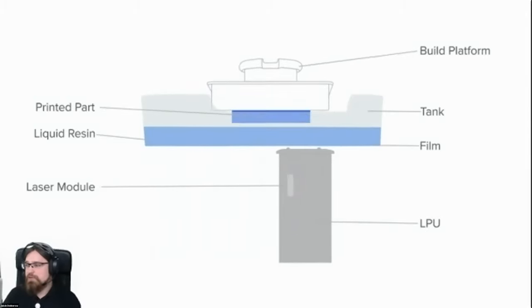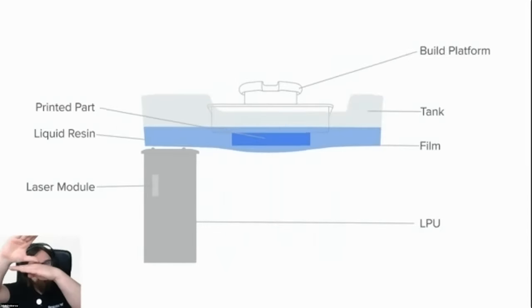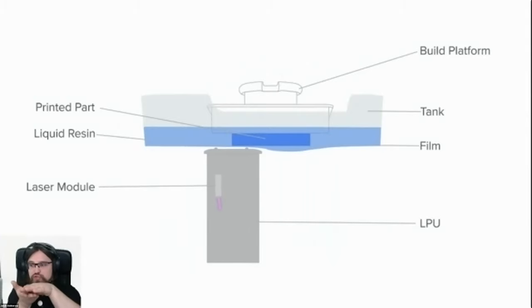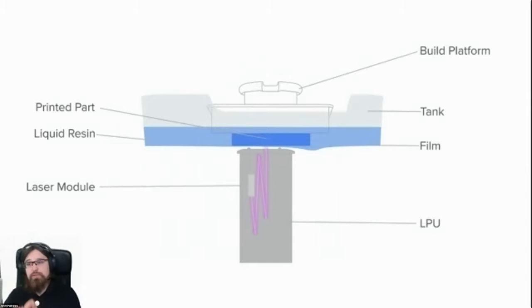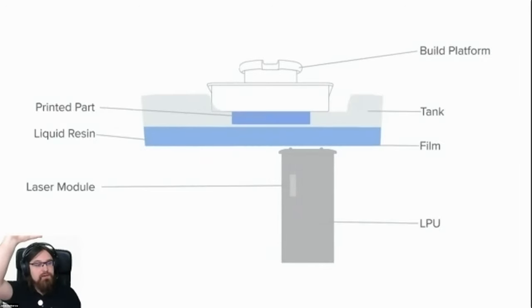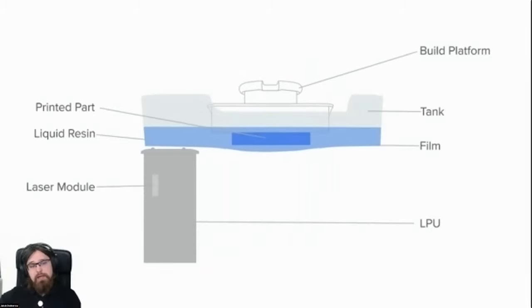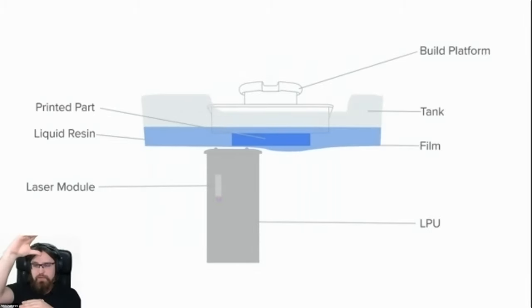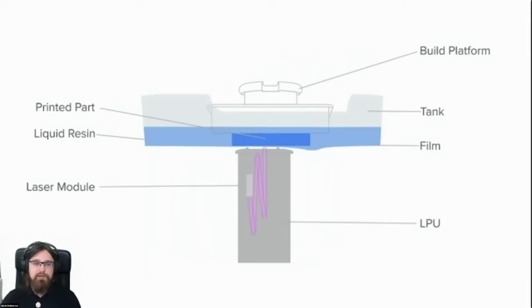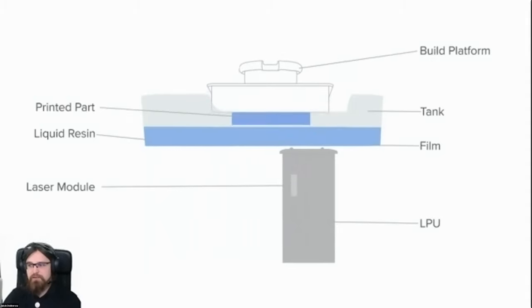So, just reiterating this real quick, we take what we have already printed, dip it into the resin until we leave just that space to the bottom of the tank, squeeze the excess resin out, cure the next layer of resin from the bottom onto there, and then we have to detach everything from the bottom of the tank and go back into the resin. And that's basically what we always do. And then when the print is finished, the build platform will be all the way on the top, and your models will hang upside down on the build platform. And then you will do everything that Bernhard just showed you a minute ago.